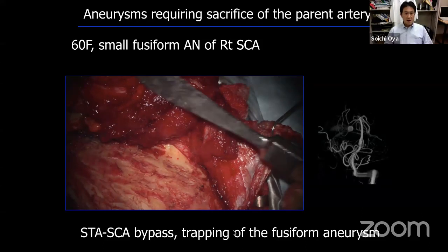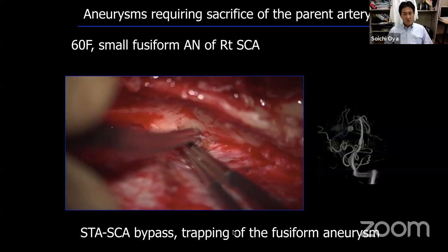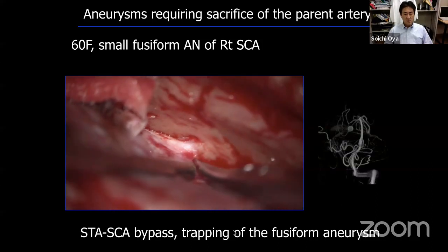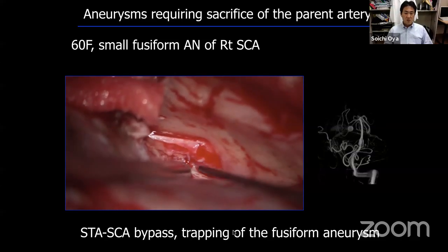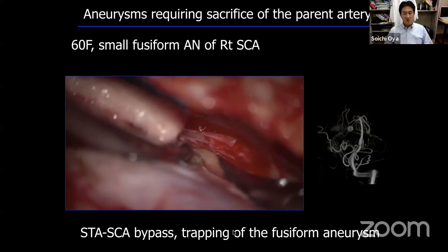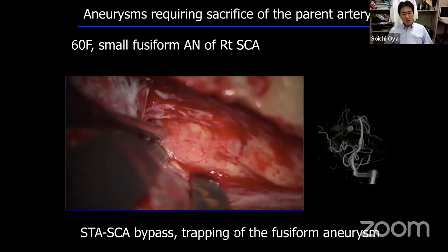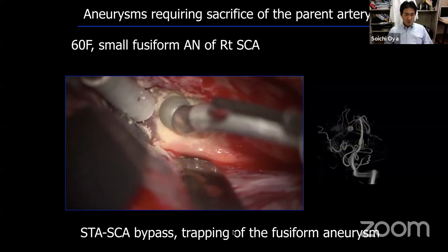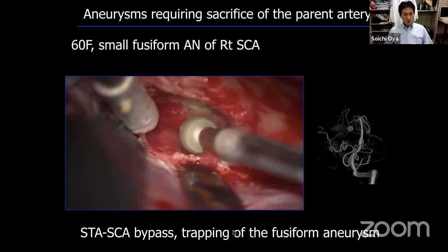This is the supramastoid crest, which corresponds to the height of the tegmen of the temporal bone. This is the facial hiatus and the GSPN. I'm checking the course of the facial nerve by facial nerve stimulation. And this is the so-called Kawase's rhomboid, and now I'm drilling the Kawase's rhomboid.